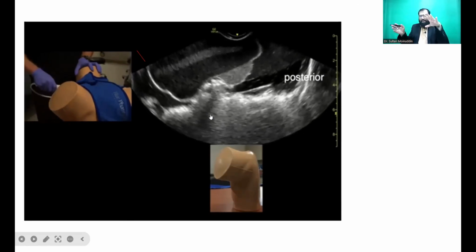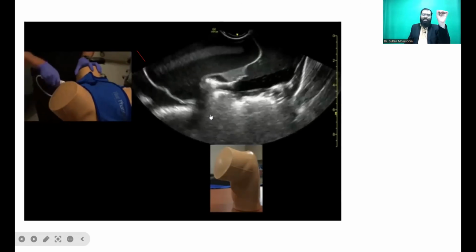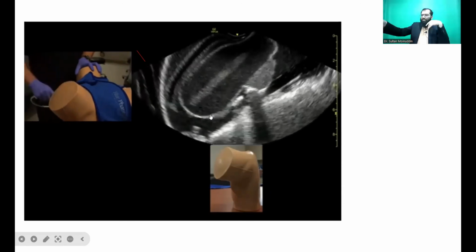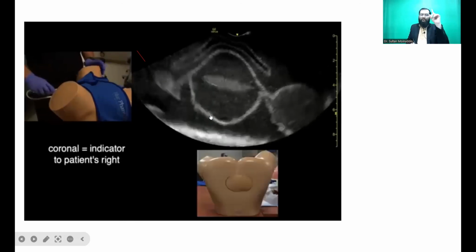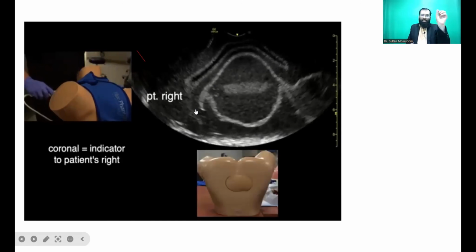Many a times I see that there is a fibroid in the lateral wall, which is often missed. That gets missed because you just put the probe, you see it in the mid-sag section, you look at the ovaries and just give it off. That should not happen. You should sweep it properly, and always, rule of thumb, try to look at anything in two views, AP and transverse.